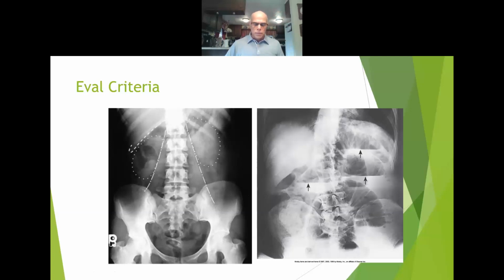The next one talks about the PA projection. It is very much similar to what we just talked about, but you're doing the PA projection, meaning that you're going to be shooting them from the back. This is when the kidneys are not of interest. If the kidneys are of interest and you're doing a KUB, you should have the kidneys on the table or against the vertical because that's going to give better detail.